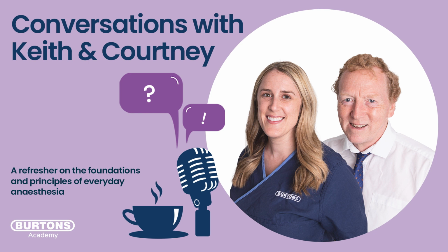Now that has some very protective properties. If you think about it, if you're ventilating a patient to, say, 12 centimeters of water pressure, and through actions by staff, mechanics, obesity, posture, or whatever, things change and the lung expansion is restricted, you still only ventilate to that same pressure, whatever you set. So that's nice, because you're ventilating your patient to 12 centimeters of water pressure.